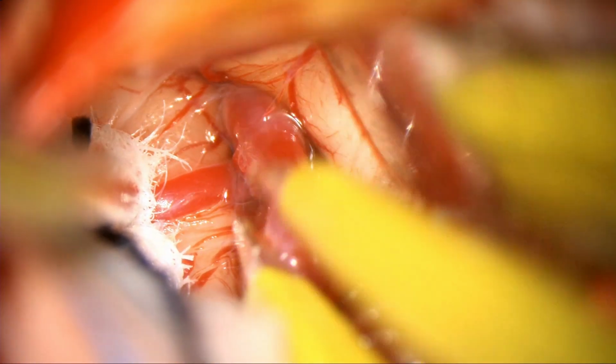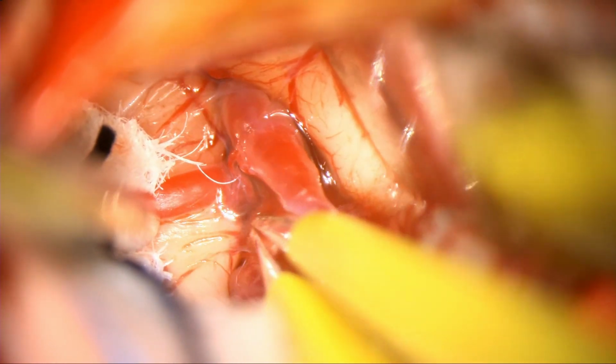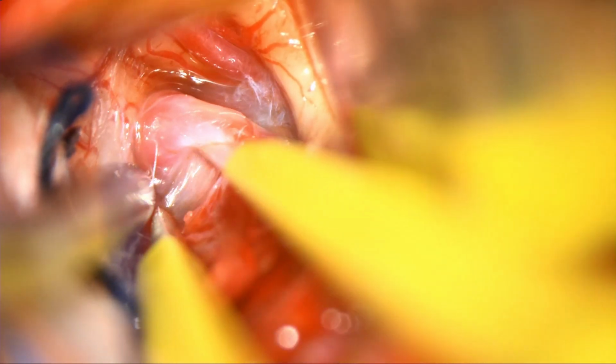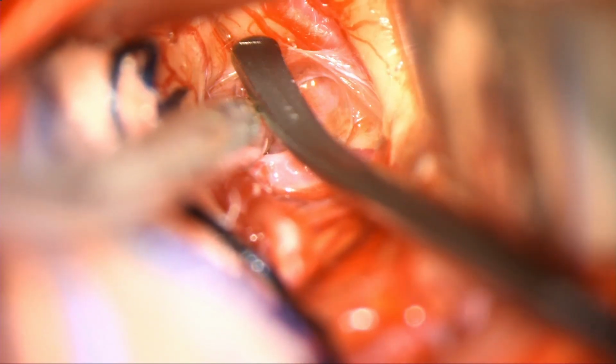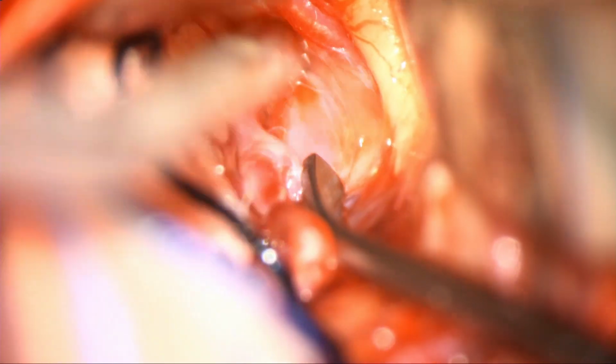We are identifying and separating these branches from the surrounding parenchyma, and small perforators are carefully separated. Further sharp dissection is continued, and the large temporal branch is separated from the frontal branch. Because this is a young individual, you will see that the vessels go into spasm very quickly. Thickened arachnoidal adhesions are demonstrated once again, requiring blunt and sharp dissection.